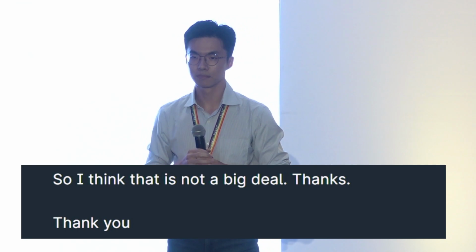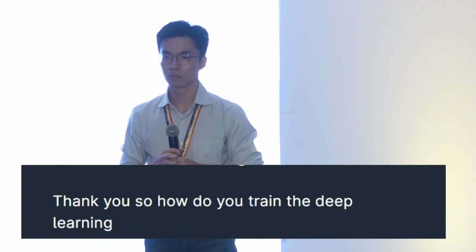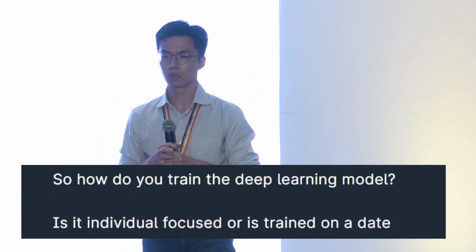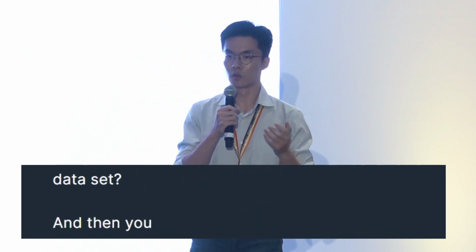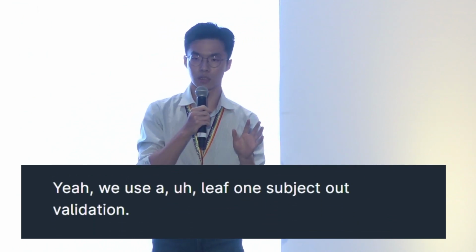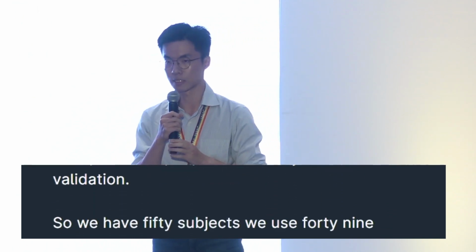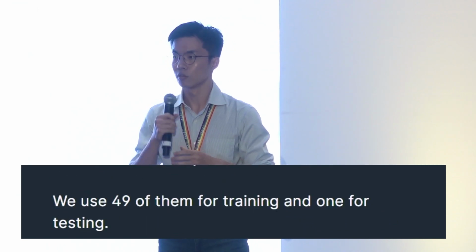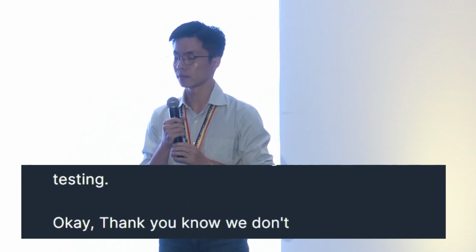So how do you train the deep learning model? Is it individual focused, or is it trained on a data set? Yeah, we use a leave-one-subject-out validation. We have 50 subjects. We use 49 of them for training and 1 for testing. No, we don't need to personalize it.